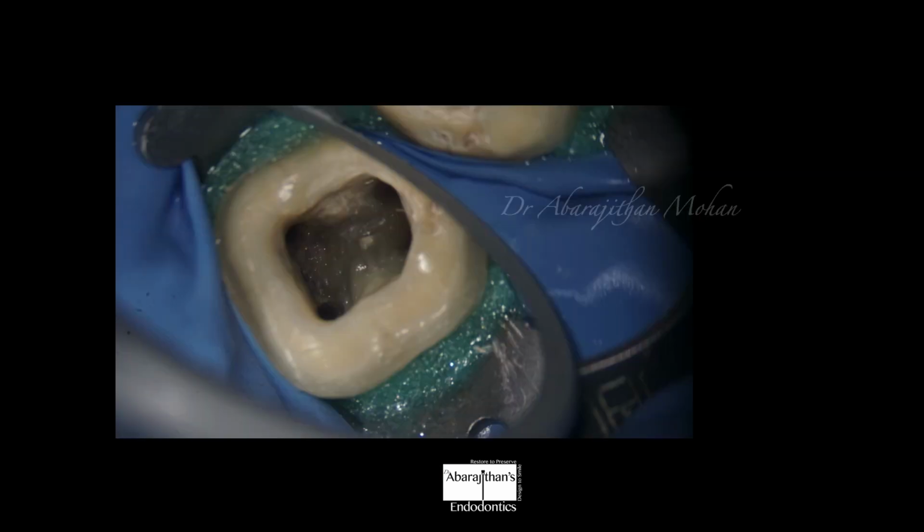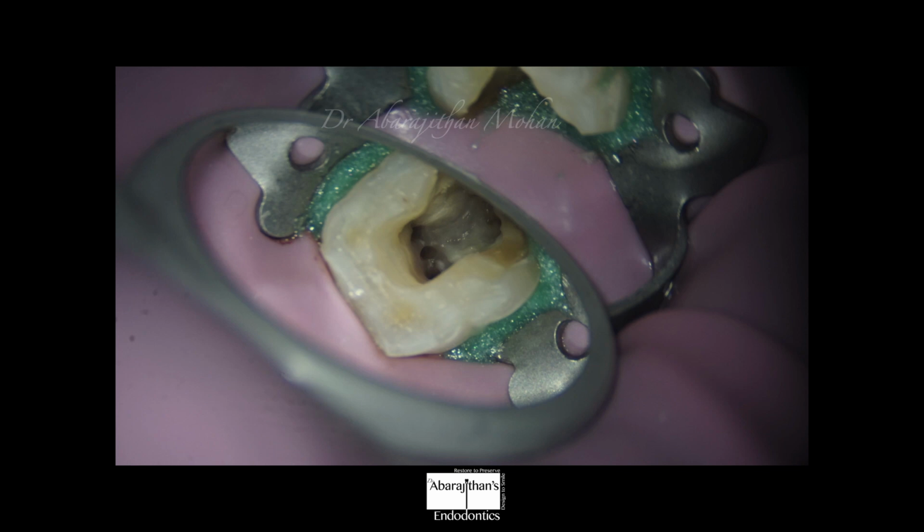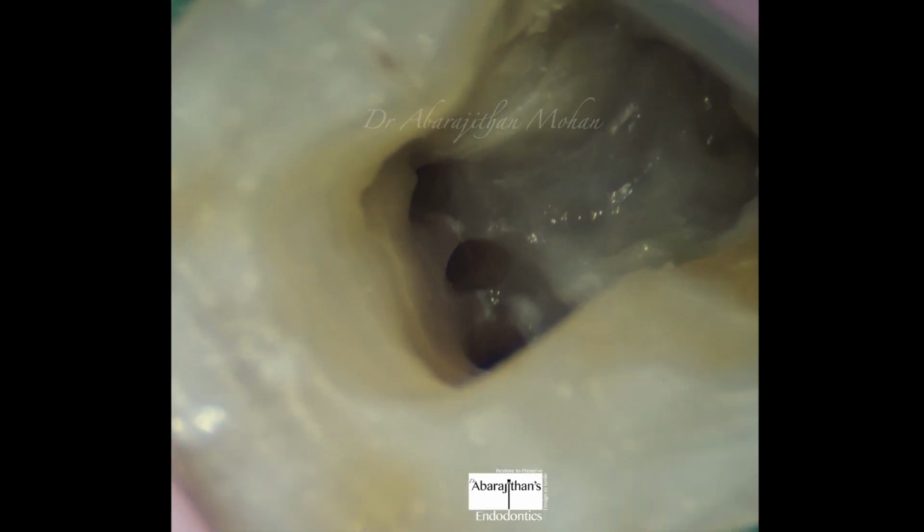When we do endodontic procedures, again you can see here a mandibular molar. This is the tooth, this is the mirror, and this is the image, and this is what we finally crop to achieve the documented image. Microscopic documentation is done after clicking pictures this way. You can see here a mandibular molar again with the middle mesial. Once I work, I also keep clicking pictures. This is the unedited image that I get, and later I can crop it, and this is what I use for my documentation and presentation.